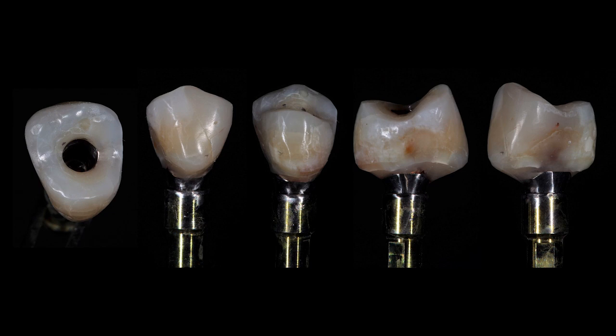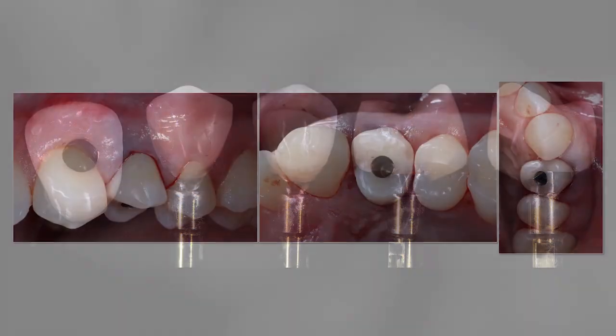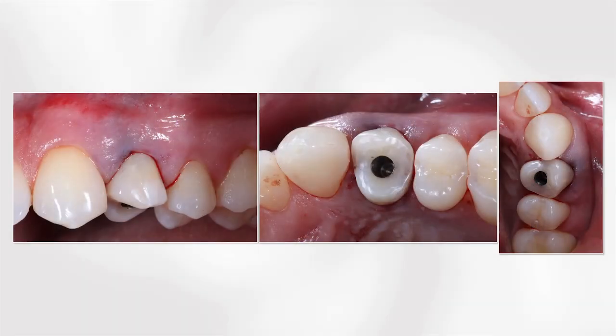The provisional restoration was performed using the same crown from the patient. We just added composite resin at the cervical area, and the ideal emergence profile was created here. Right after this provisional restoration was placed over the implant, take a look at the length of this crown. It's shorter than the neighboring teeth in order to protect this tooth from the occlusion.